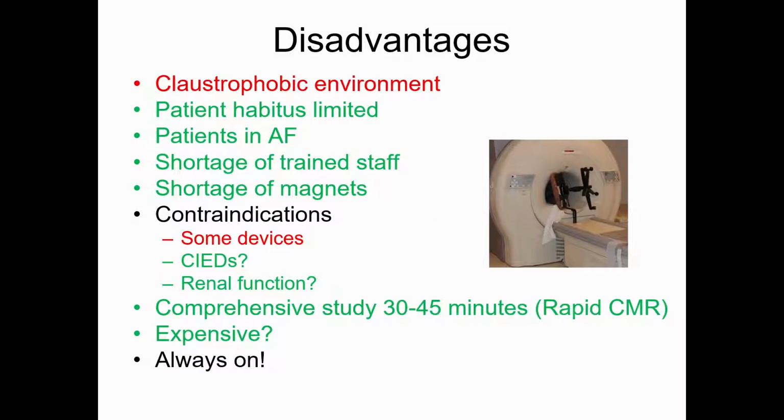There are now lots of studies of thousands and thousands of patients to show that it is safe under certain conditions to scan most of those legacy devices. And in fact, the manufacturers are retrospectively recognizing that their devices increasingly are MR conditional and so safe to scan. So we do scan non-MR compatible devices. There are tiny handfuls of ones that we don't particularly want to do, particularly if the clinical indication is soft, and we would choose other modalities. I think one of the things that people have always talked about is MR just feels a bit long and complicated, it's hard to do, but that is evolving really rapidly now.